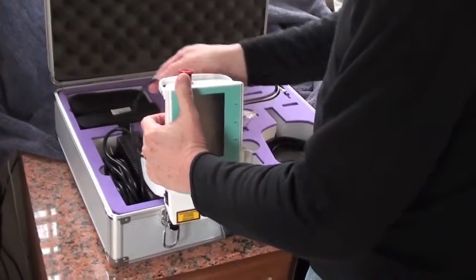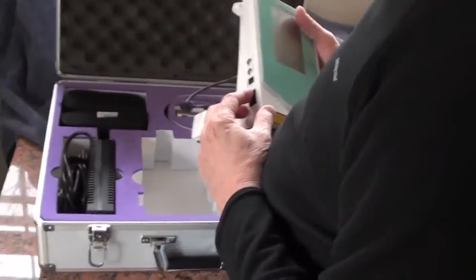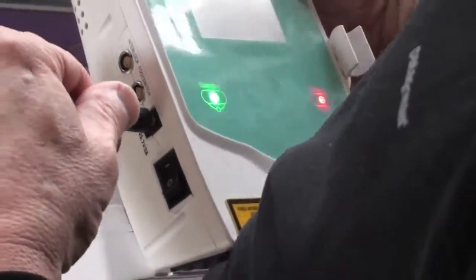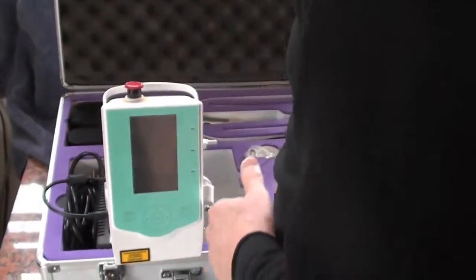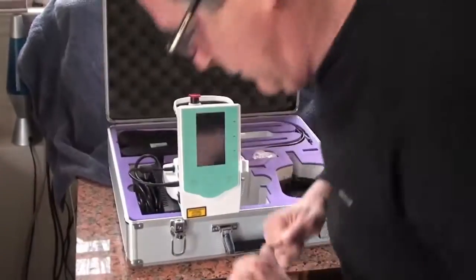We'll show you how to first hook it up with the battery. I wouldn't recommend hooking this up until you make sure it's off. This is in the off position. Everything should be in the off position or it will spark. That's the off position. Okay, you hook it up like that. And then here's the foot pedal. It's the same foot pedal. We're going to use the foot pedal.